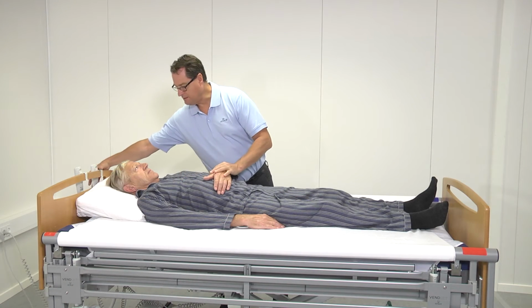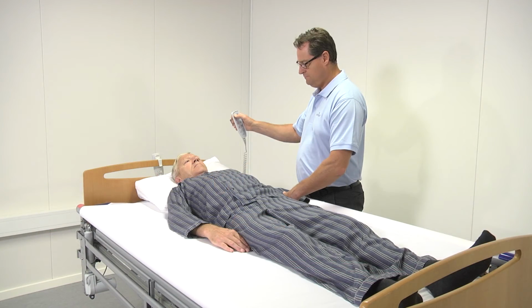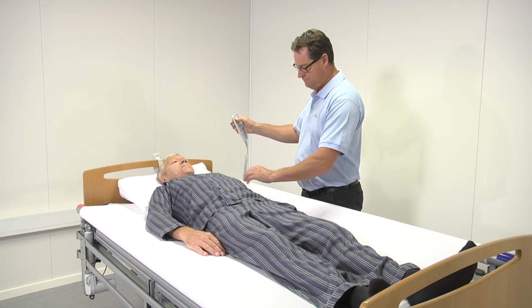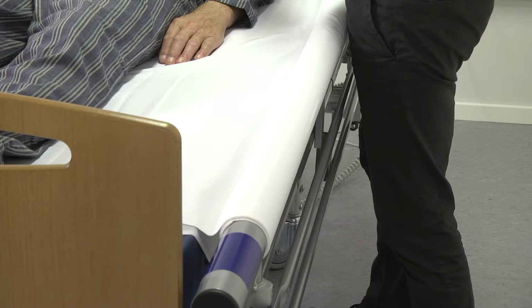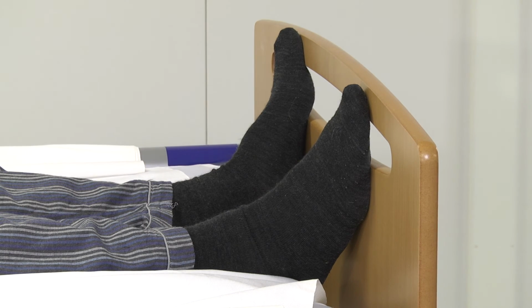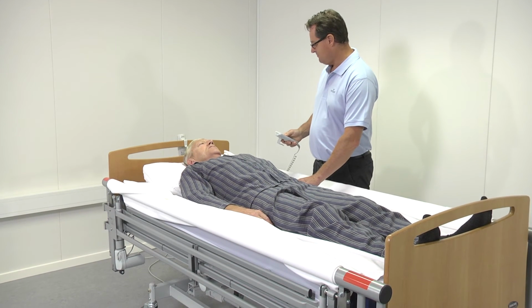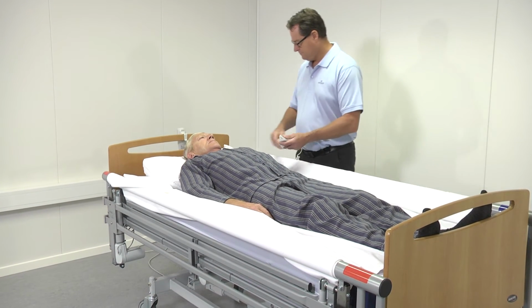When the client is moved back to the middle of the bed, the sheet is wound onto the red bar. Slacken the sheet on both sides. If the client slides down towards the foot of the bed, the VENDLET system can be used to bring him back up. Slacken the sheet on the blue side and slightly raise the bars to create a sense of safety.